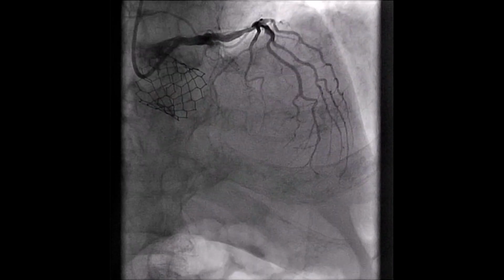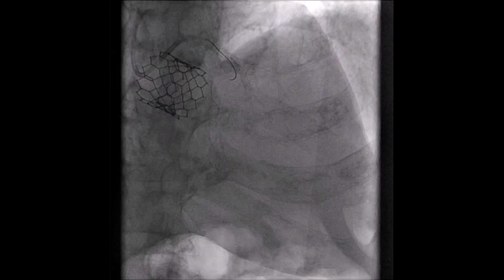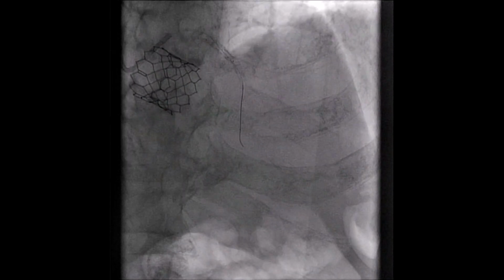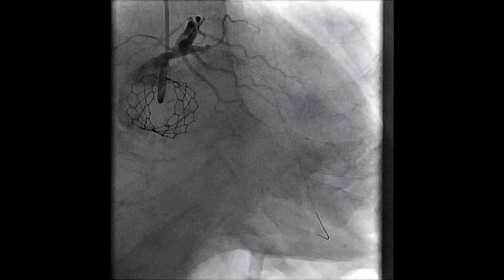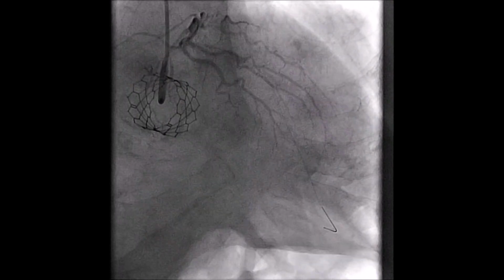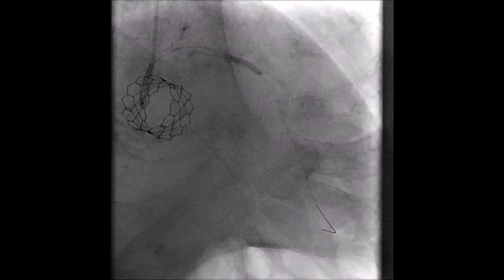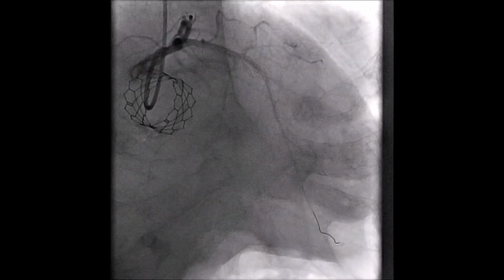In this way, now that we know where the obstruction is, we can only treat it. The first thing is to pass an angioplasty guide wire through the occlusion. Sometimes the passage of the guide wire partially unclogs the artery and allows us to see part of the distal bed, but this is not the case. So, an in-stent predilation was performed in order to regain blood flow and reevaluate the extent of the disease.